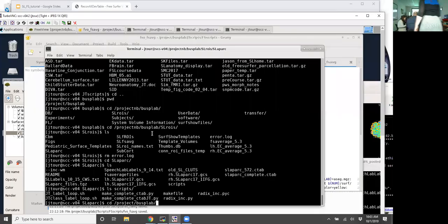When I sat back down, I thought I had a pretty good handle on the common additional things you might want to do with the outputs from Freesurfer, and I realized there are actually a bunch more things we should go over, and I don't have those done explicitly in detail, like how to do that. The syntax you use for calling Freesurfer commands changes from one function to the next. So rather than speculate, I'm just going to leave that as a bit of a to-do. There is more stuff we can go over coming up for sure.